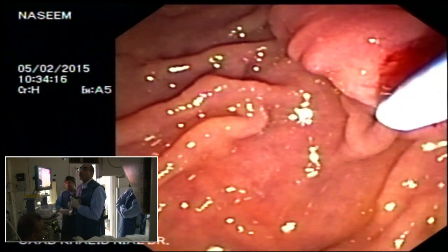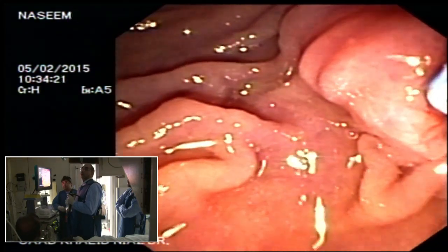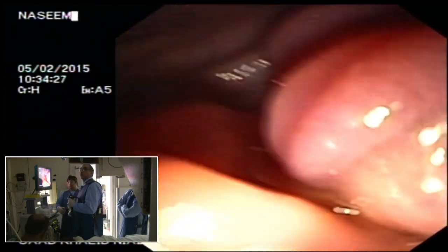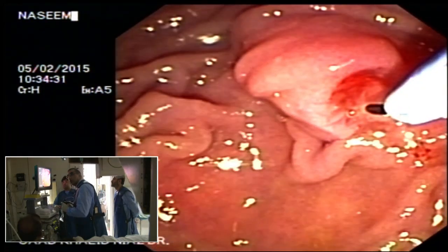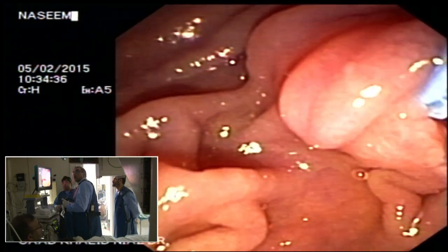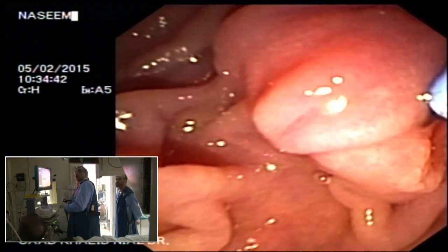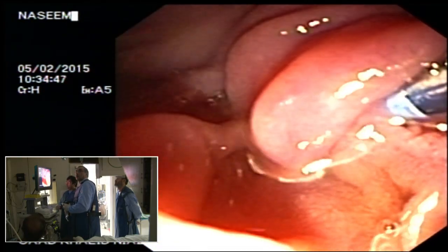In the pancreatic cancer case, yes, you can, but I would not suggest a fistulotomy in a simple bile duct stone case. You need to know exactly where the bile duct is to do the fistulotomy. So you have to have a really good concept and a sixth sense, what I call it, to get an idea where the bile duct is coming. This is a modified pre-cut, but you are not using the ampulla, you are using the space above the ampulla.